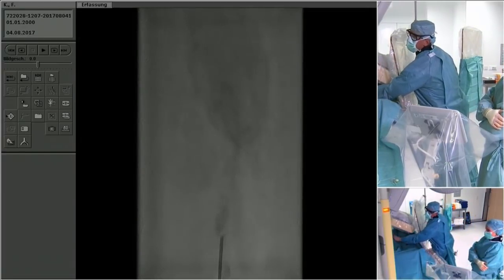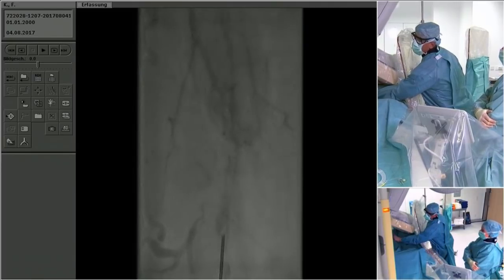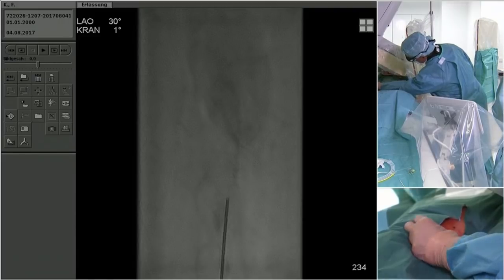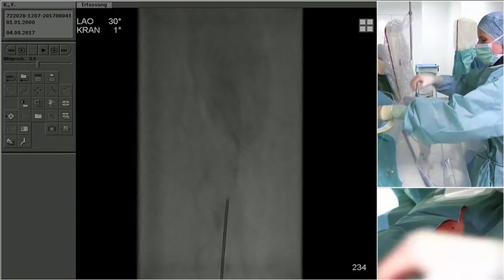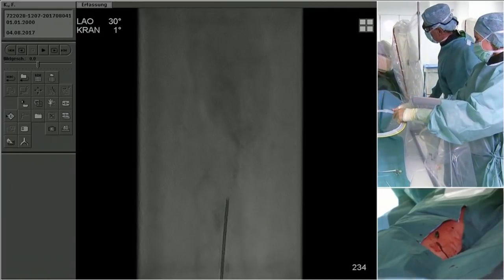I really go supine, no more prone, and I go to the highest point I see in the anterior tibial or posterior tibial artery, the highest point by ultrasound. Any other comments here? Andrej, why not posterior tibial? I know it's a single vessel runoff, but you could have a 4 French slender sheath, a 4 French coaxial 2.6 or 2.3, and try to cross this retrograde, no bleeding risk, plenty of working room to try to recanalize. I mean, you guys are obviously experts at that.